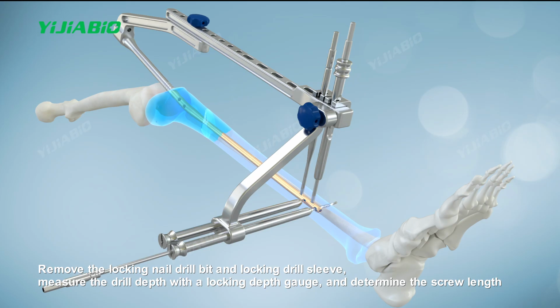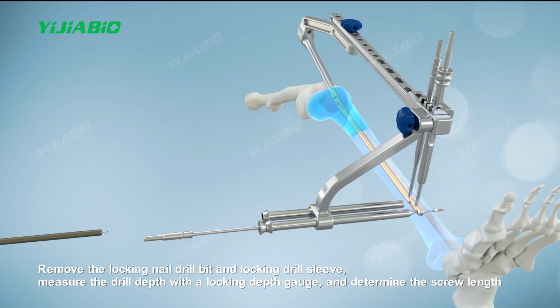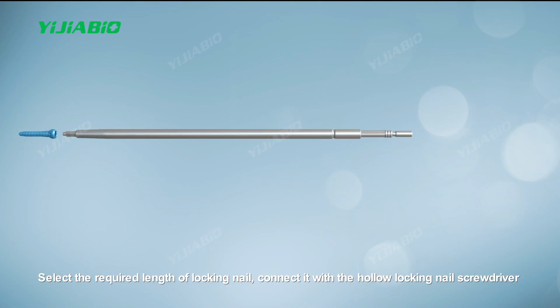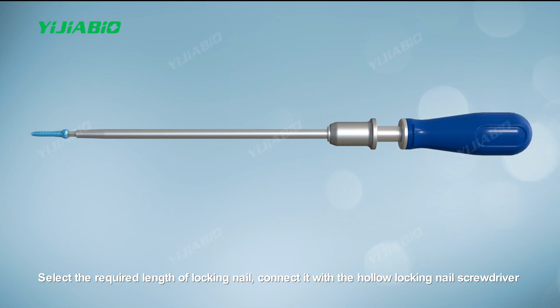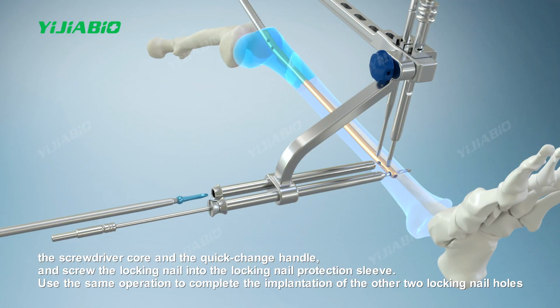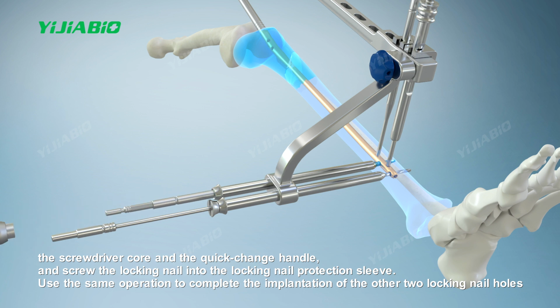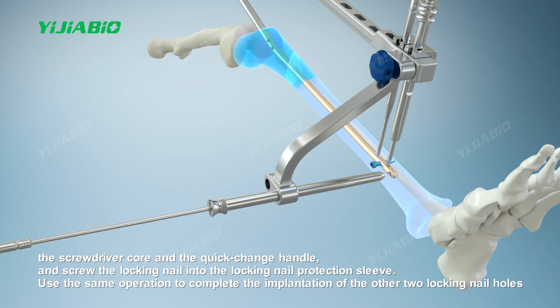Remove the locking drill bit and locking drill sleeve. Measure the drill depth with a locking depth gauge and determine the screw length. Select the required length of locking nail, connect it with the hollow locking nail screwdriver, the screwdriver core, and the quick change handle, and screw the locking nail into the locking nail protection sleeve. Use the same operation to complete the implantation of the other 2 locking nail holes.